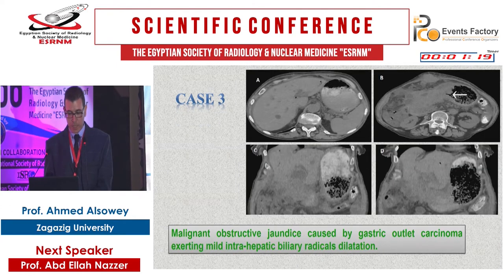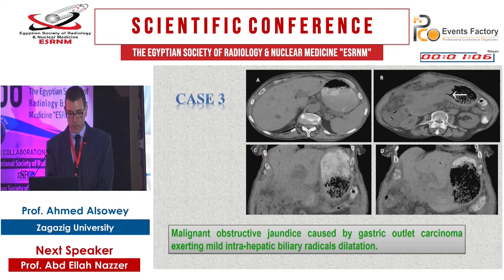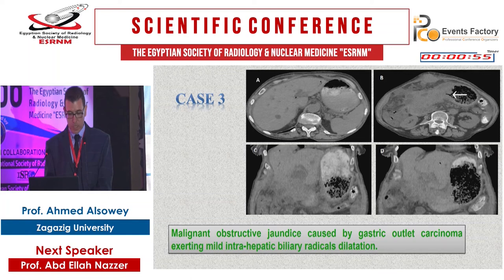This is a case of renal impairment where no intravenous contrast was administered. There is a large gastric mass in the gastric pylorus as well as a solid mass in the anterior abdominal wall. This mass is seen infiltrating the inferior liver surface and causing biliary obstruction, representing malignant obstructive jaundice caused by gastric adenocarcinoma with intrahepatic biliary radical dilatation.